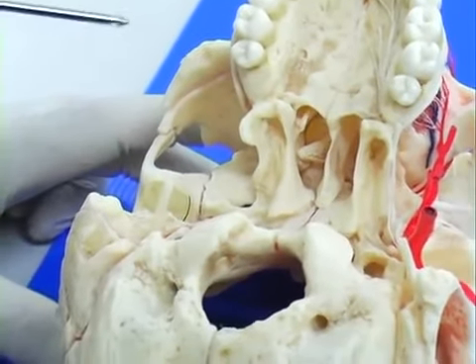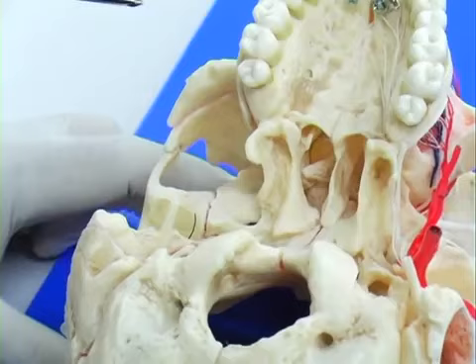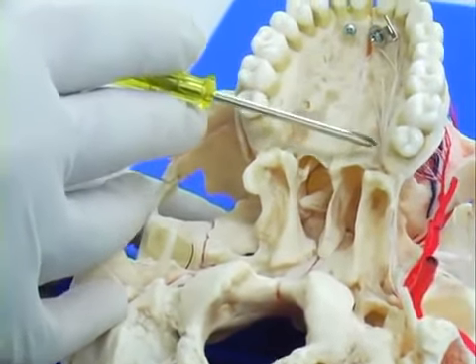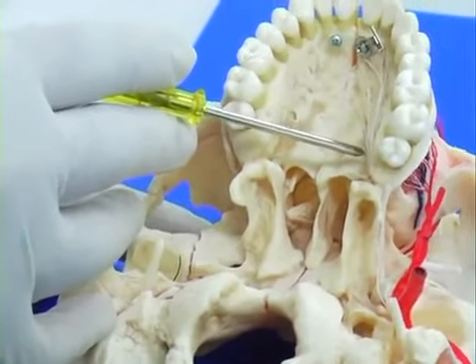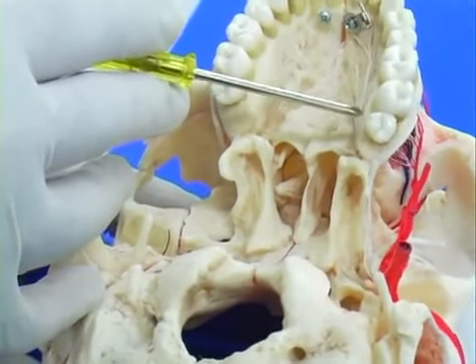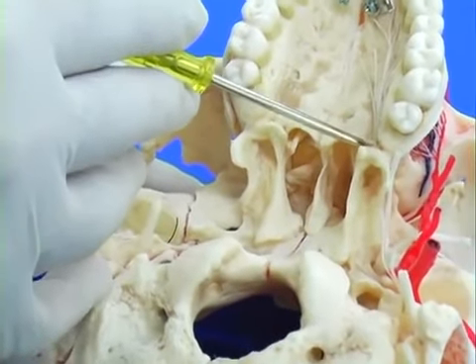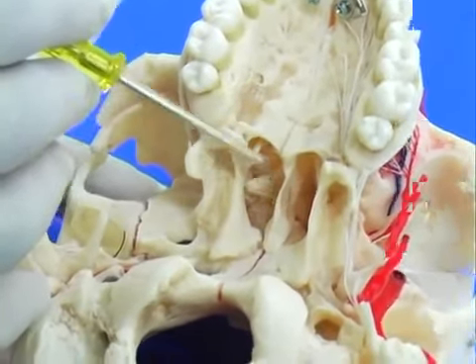While you are injecting or infiltrating to anesthetize the palatal area, it is important that you should not cross the distal part of the 7. Otherwise, the lesser palatine nerve will be anesthetized and the patient can gag.